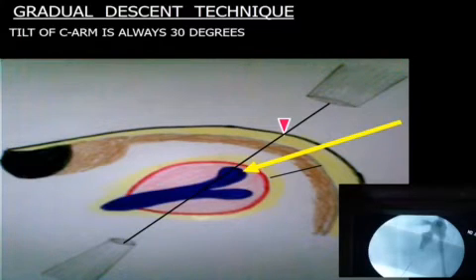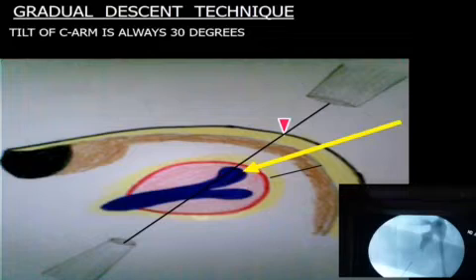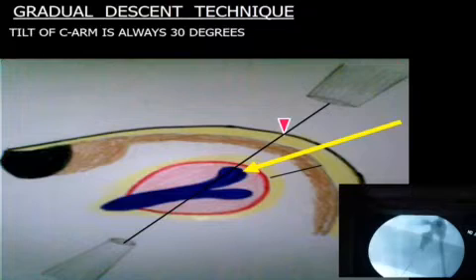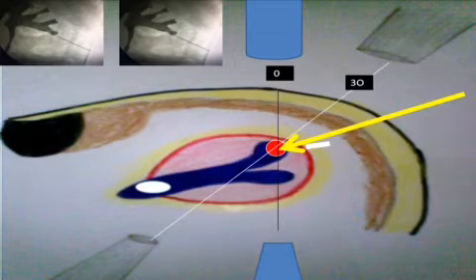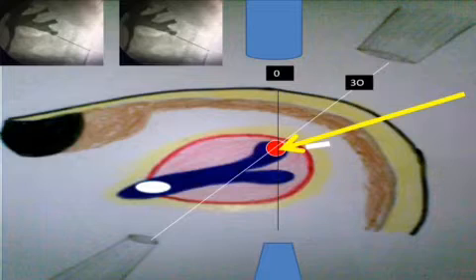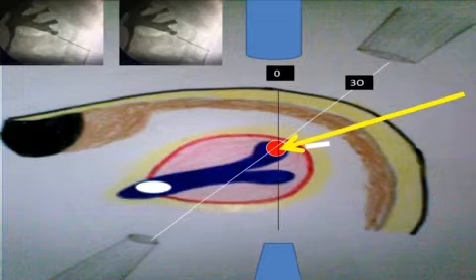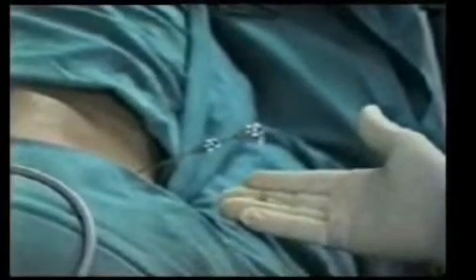In gradual descent technique, rather than starting the bull's eye at the target area, I place the needle 3 to 4 cm lateral of the target, then descend the needle so it hits the target. I then confirm in both 30-degree and 0-degree views — if the needle tip remains at the target in both images, I am correctly positioned. This is how the needle is gradually advanced toward the renal cortex, like an aeroplane landing on a runway.